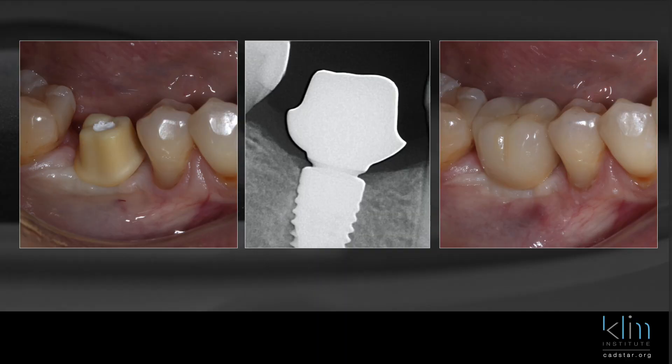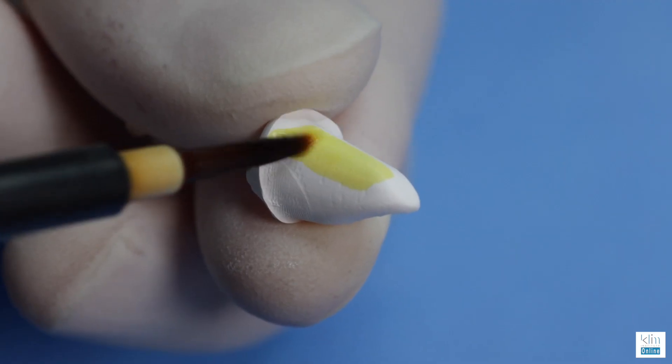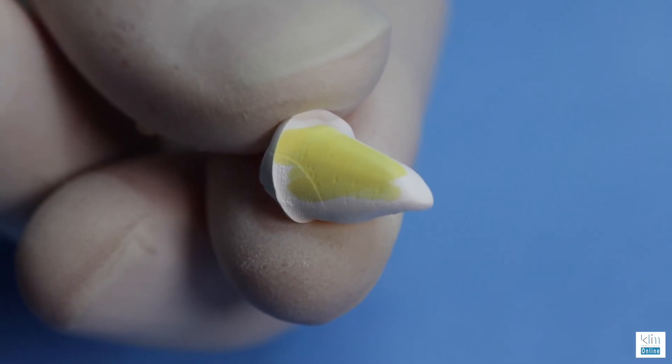In my clinical theater, I will optimize my zirconia abutment by placing infiltration — a coloring system — into the zirconia before we sinter.